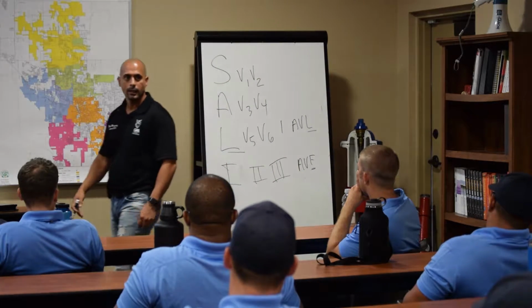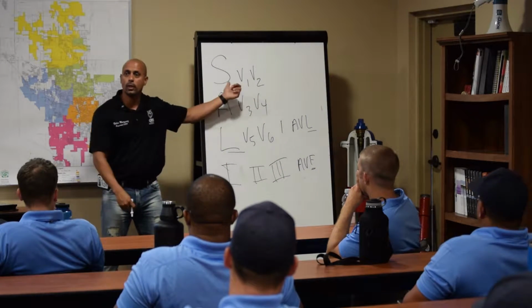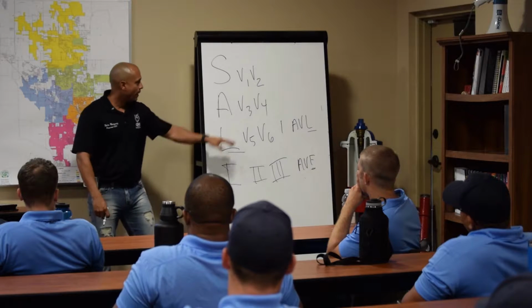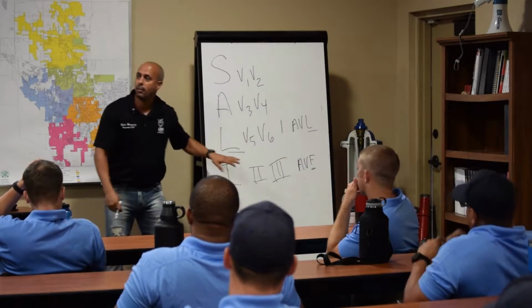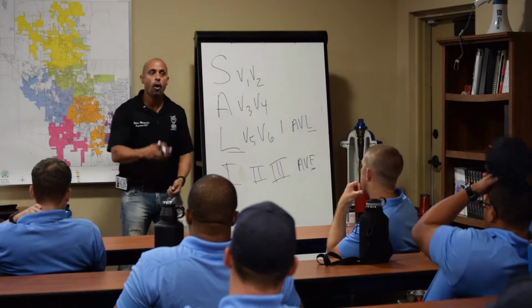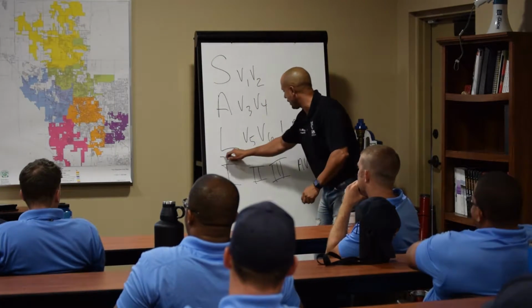That's it. If I have elevation in V1, V2, what kind of MI is that? If I have elevation in 3 or 4, it's a what? Anterior. 5, 6, or 1 and AVL, lateral. 2, 3, AVF, inferior. Or you can even break it down even further, right?